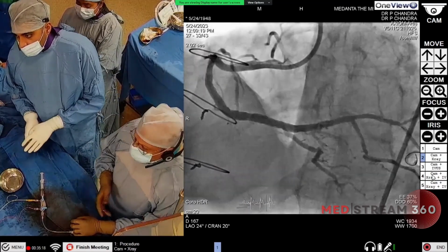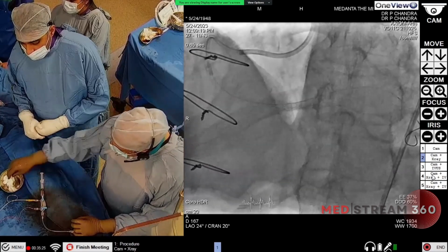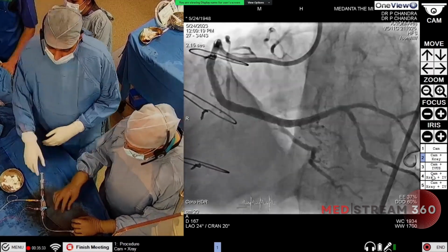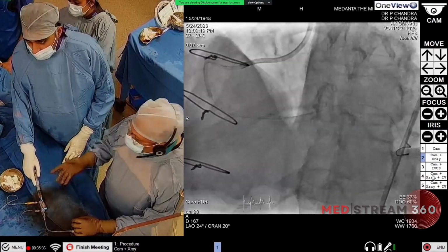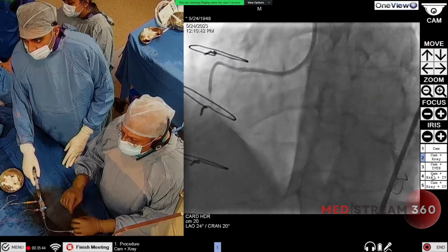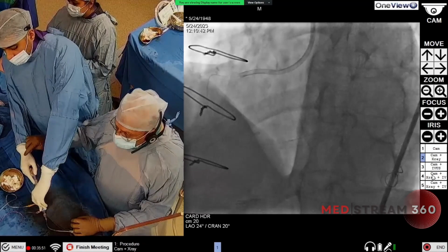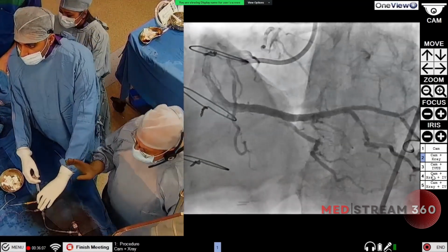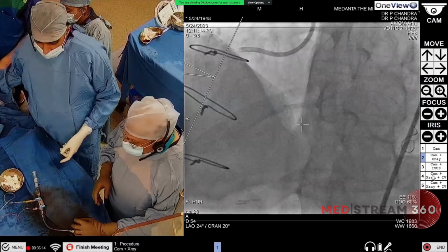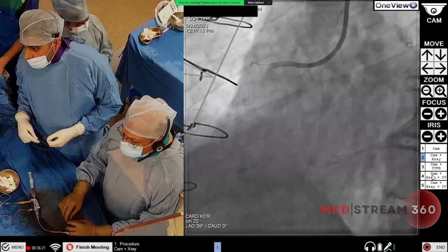So with this, I think in this very heavily medium calcification, and also that there is a side branch and so much tortuosity, we were able to deliver the shock wave, which was a 3.5 balloon, and a stent which was 3.5 by 30 millimeter long, and this was all on a BMW wire. Okay, so I'll take this guide extension gradually, careful. Yeah, okay, and then we must take a shot because sometimes there could be an injury in the proximal segment. Planning before, and the use of the CT images was quite helpful because we knew upfront that this is a patient who will have calcific lesions, and we have to be prepared with the devices which can take care of the calcium.